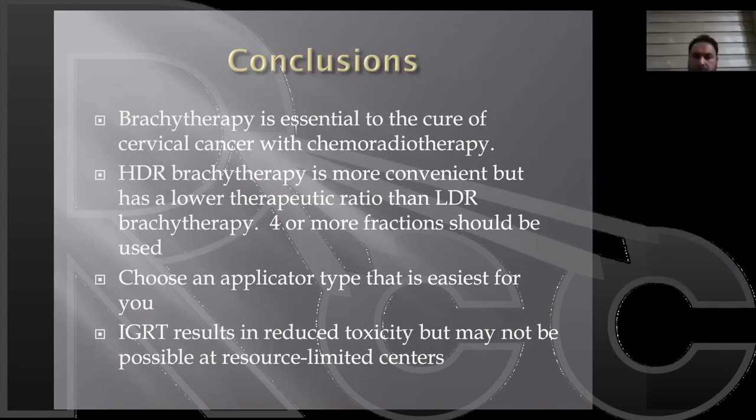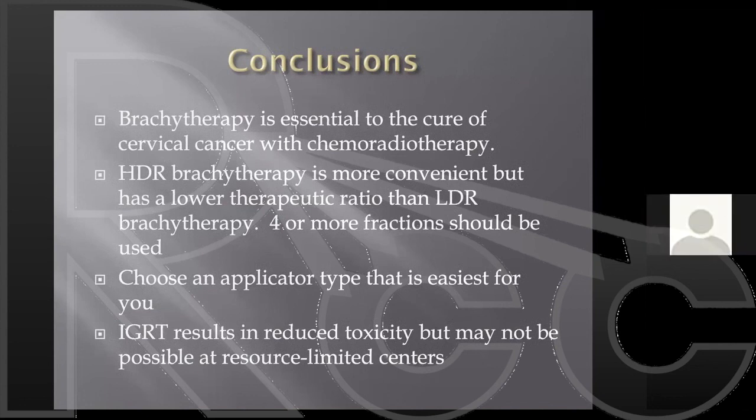You talk about these cure rates, and I think you made a really good point about GEC-ESTRO and EMBRACE II, where 60% of the cases were using interstitial needles. So definitely keep that in mind as you are planning without needles, that you probably won't be able to achieve everything, and don't be discouraged or push things in some weird way. Stick to conventions, as Dr. Eink has suggested, and you'll still get good cure rates, maybe not as good as with interstitial needles, but that's a very important point.